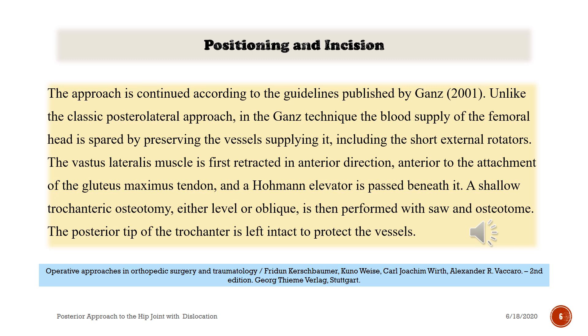The vastus lateralis muscle is first retracted in an anterior direction, anterior to the attachment of the gluteus maximus tendon, and a Hohmann elevator is passed beneath it. A shallow trochanteric osteotomy — either level or oblique — is then performed with a saw and an osteotome. The posterior tip of the trochanter is left intact to protect the vessels.